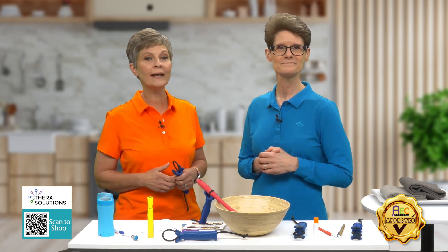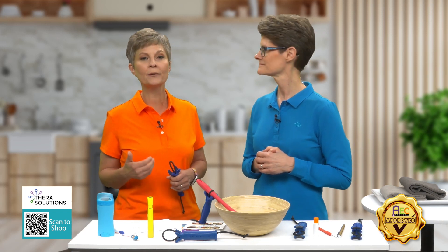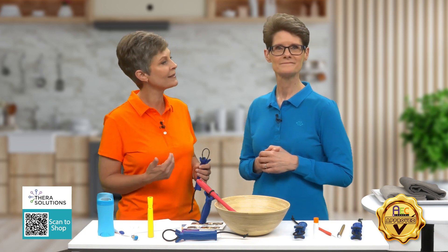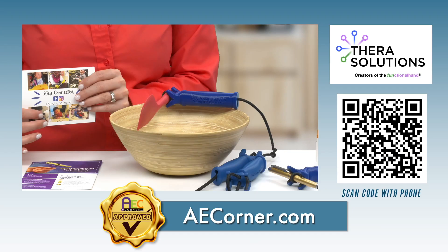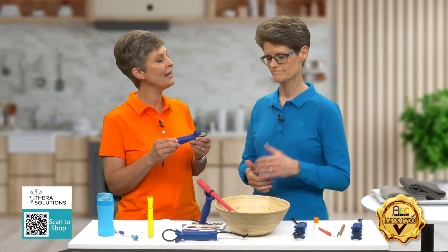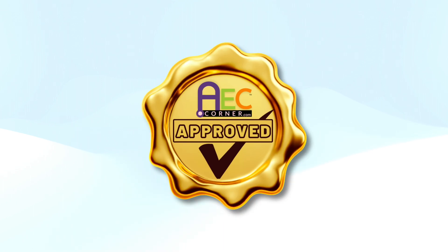Whether for adults during daily and leisure activities or for children learning through play, the Functional Hand will assist in improving independence. If you think the Functional Hand may be helpful for you or someone you love, be sure to scan the QR code on the screen or visit aecorner.com. I say the Functional Hand gets the AE Corner seal of approval.